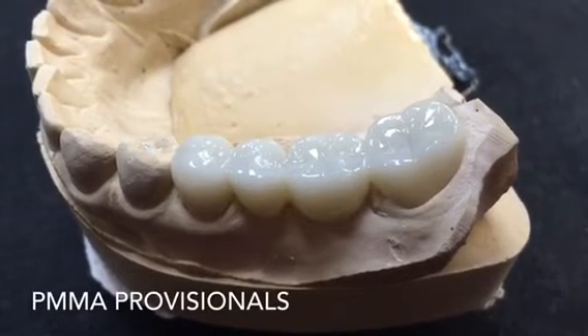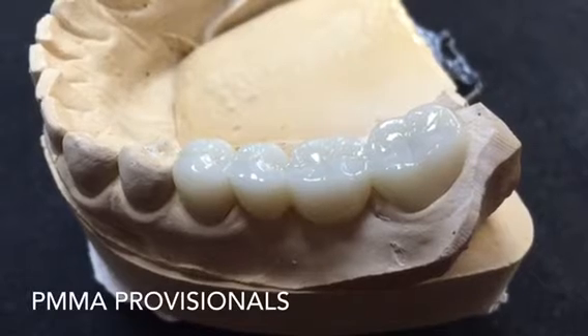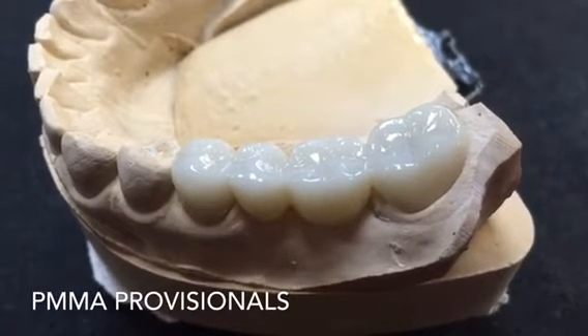My blog today will be about PMMA fabricated provisionals. These provisionals are fabricated in a dental laboratory like BioTemps laboratory.